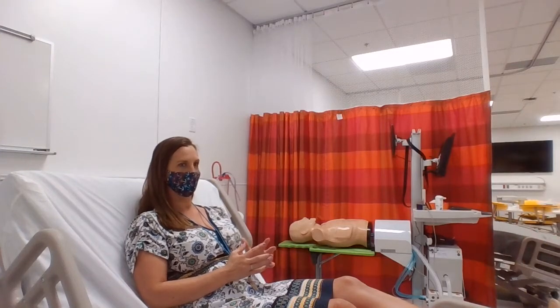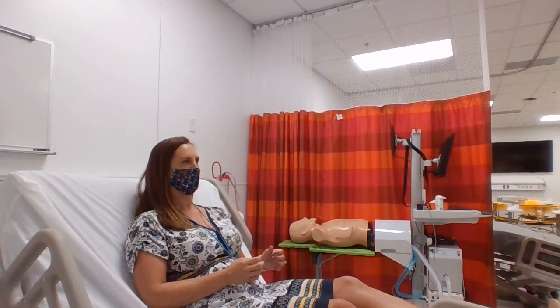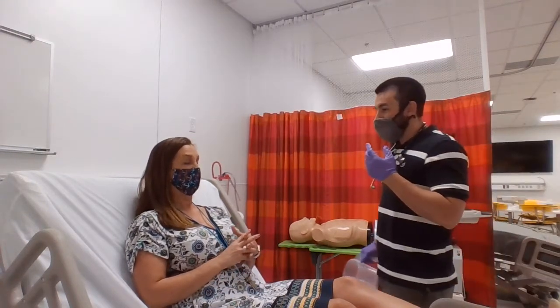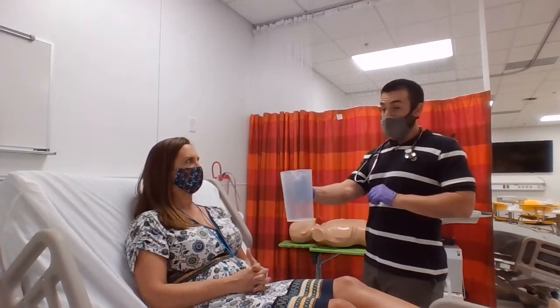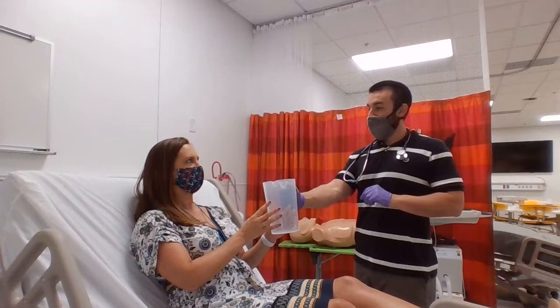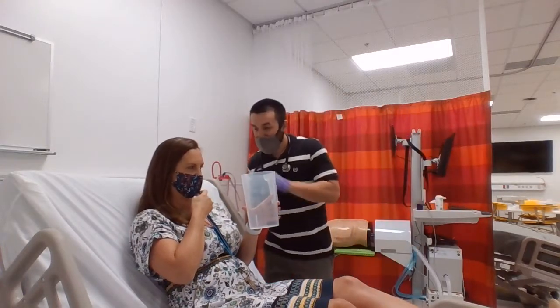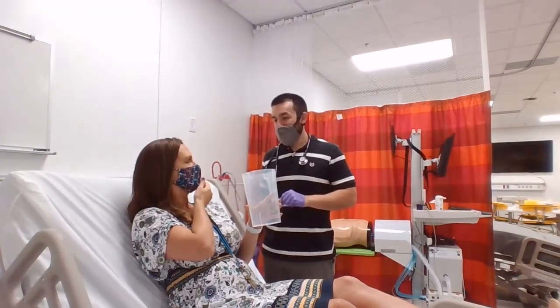This drug has two drugs in there. One of them is an inhaled steroid. If you get that powder on your tongue and in your mouth, it can cause a nasty fungal infection called thrush, and it's not very pleasant from what I've seen and heard. So I brought you a small cup of water here. You always want to take a nice big swig of something, swish it around really good, and then spit that stuff out.